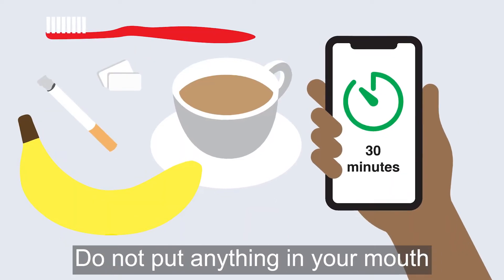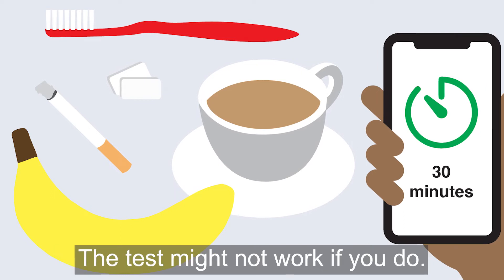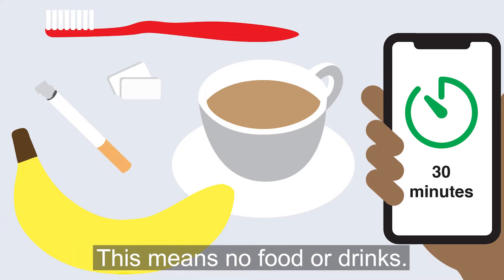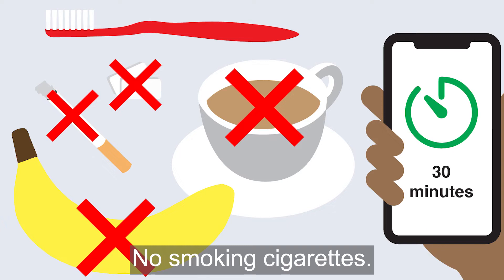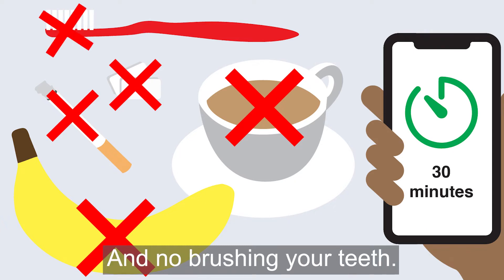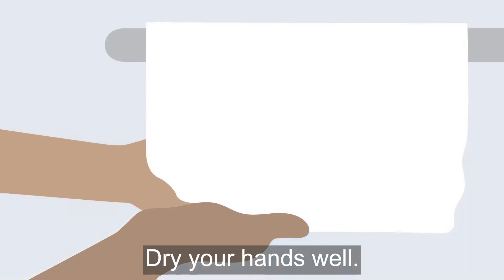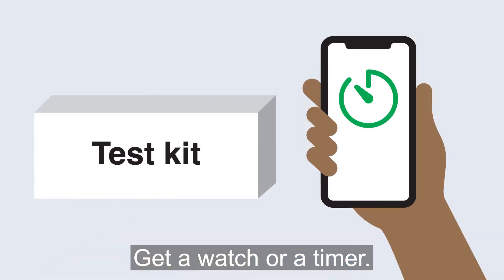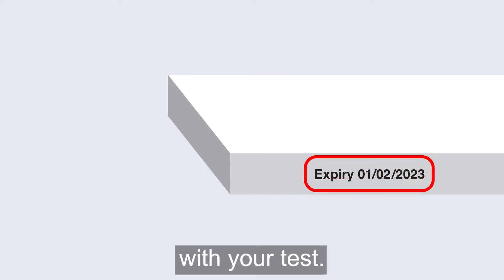Do not put anything in your mouth for 30 minutes before you do the test — the test might not work if you do. This means no food or drinks, no gum, no smoking cigarettes, and no brushing your teeth. Wash your hands and dry them well. Get a watch or a timer.